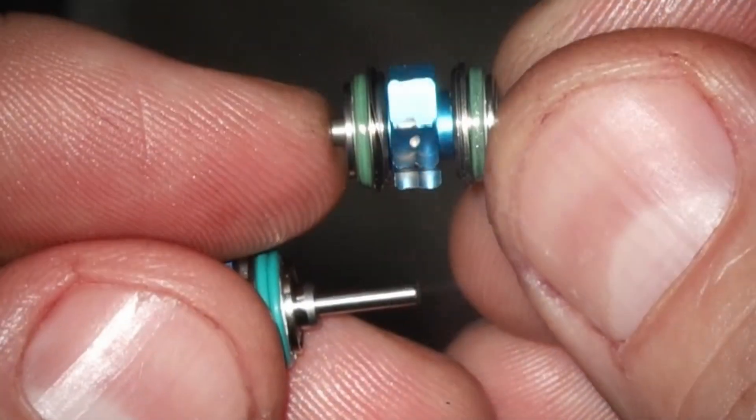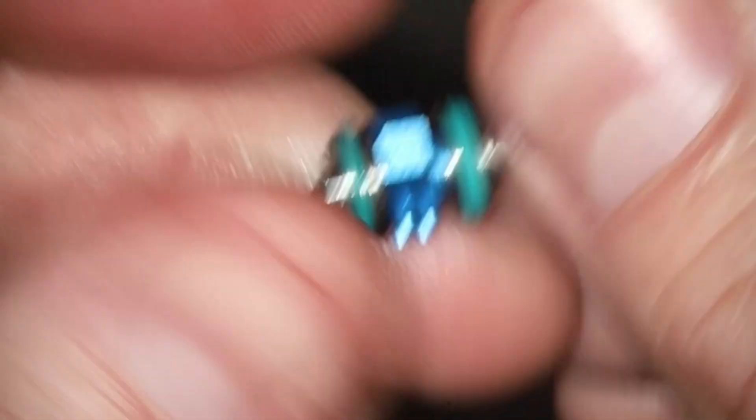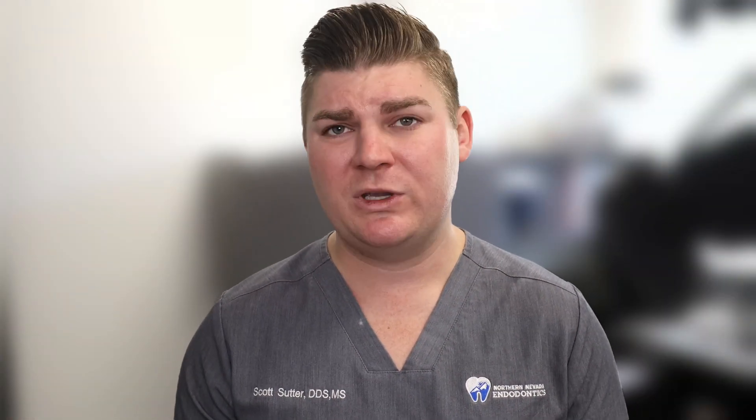This turbine has had a lot of wear on the individual veins, so that is why it was no longer spinning or keeping torque when I was working on patients. Compare that to a new one. You will sometimes see that the bearings have broken or that a vein is missing from the turbine. Regardless, these are all signs that you need to replace the turbine.